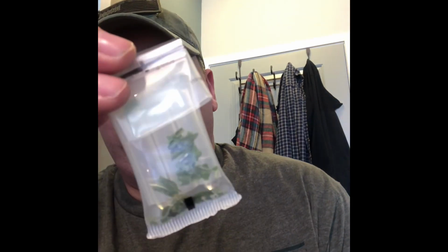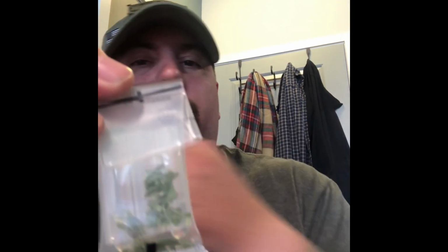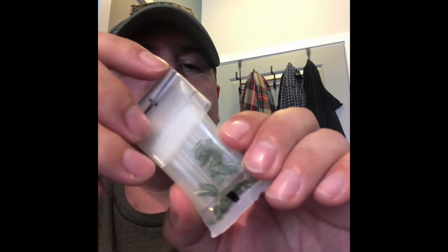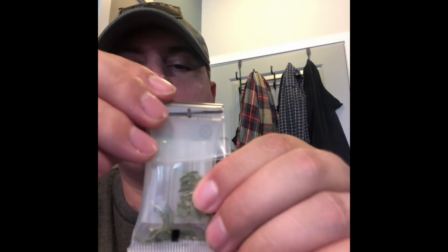It's tough because when you see a video on the internet, you don't really get all the story, and you don't know what's edited and where and how. Not to say any of you have to trust me, but I haven't edited this, and I'm not really a guru on the video recorder. So we have oregano in here, which obviously we wouldn't mistake for heroin, so we wouldn't even be testing this out in the field. But for the sake of argument, here we go.